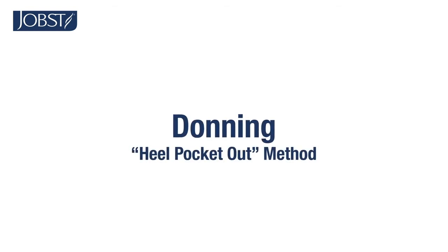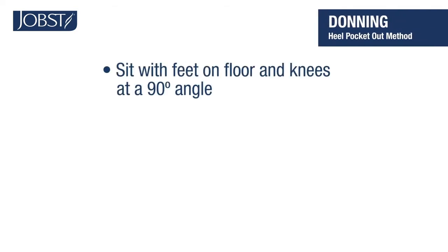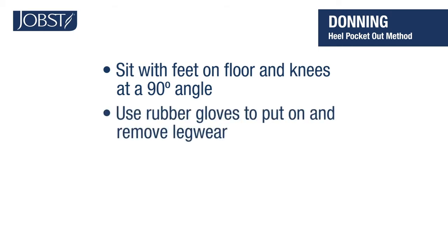Donning, heel pocket out method. The best way to put on your compression stocking is to sit with your legs in a natural position, feet on the floor so your knees are at a 90-degree angle. If you prefer, you can use your rubber gloves when you put on and remove your compression stockings. They can help protect the hosiery from nails or dry skin.